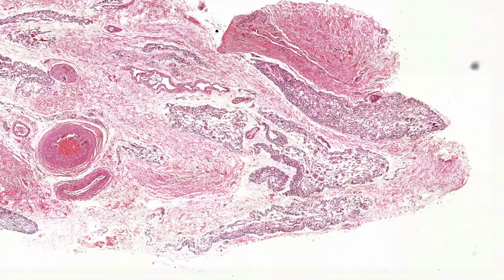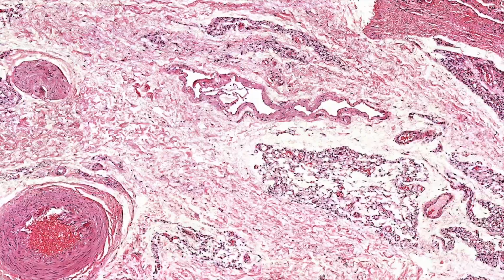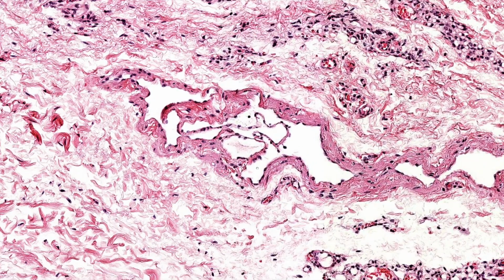And oftentimes too, I will see some degree of fat atrophy in association with fat necrosis. In traumatic fat necrosis or lipodermatosclerosis, oftentimes you will have some atrophic fat mixed in with the necrotic fat. Cool.